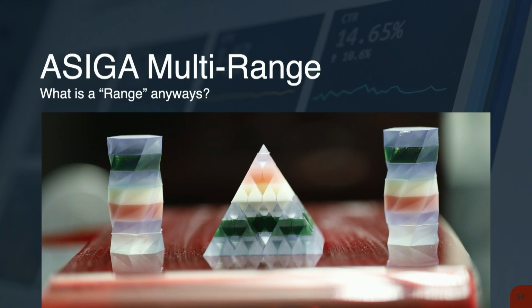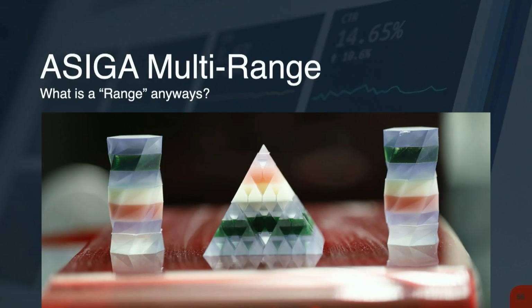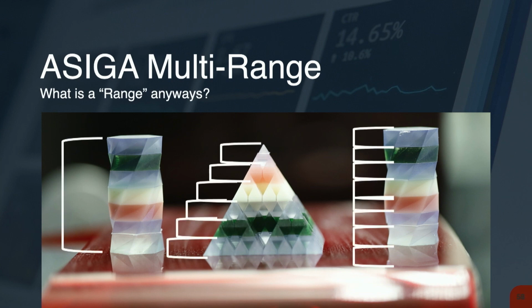So this is like a clear resin material. This is like a key splint soft, I think. This is a gingival material, temp material. And you can stack all these different materials on top of each other, and that's just having fun. But what is a range, right? A range is a set of numbers from one point to another, right? That's just what a range is. In terms of printing, what that means is a range is anywhere from 0 to the top of the print, or from this point to this point. This is a range that we define. And you're able to do that inside of the Asiga printer, because it gives you that granular level of control.